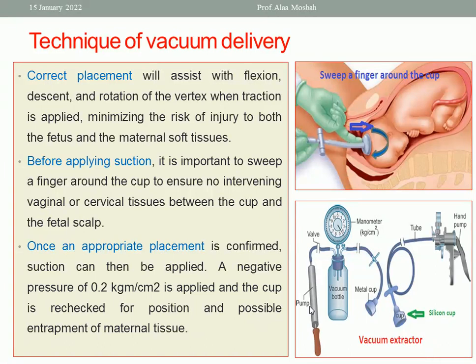How to start negative pressure? Start gradually. This is the most common use. You can start gradually or rapidly, but gradually is better. Rapidly if you are in a very emergency situation. What does it mean gradually?